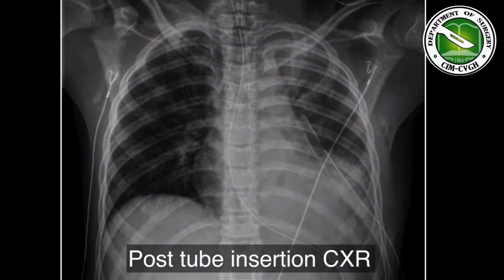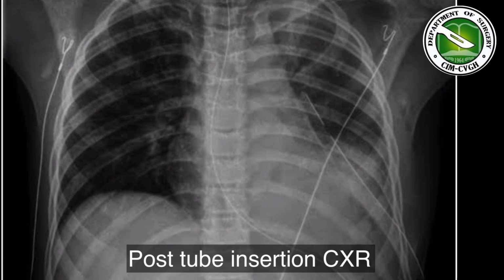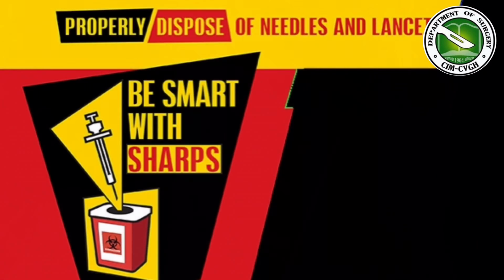Verify the position of the tube by obtaining a post-tube insertion chest X-ray. After completing the procedure, discard your waste and sharps properly and do hand hygiene.